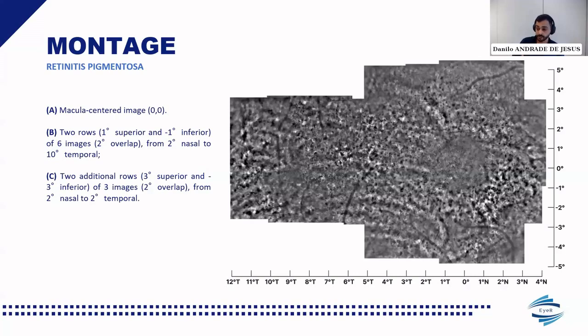Here you see pretty much a summary of our protocol. Let me quickly explain and guide you through it. We start with a fixation-centered image at 0 degrees to check the patient's preferred locus of fixation.